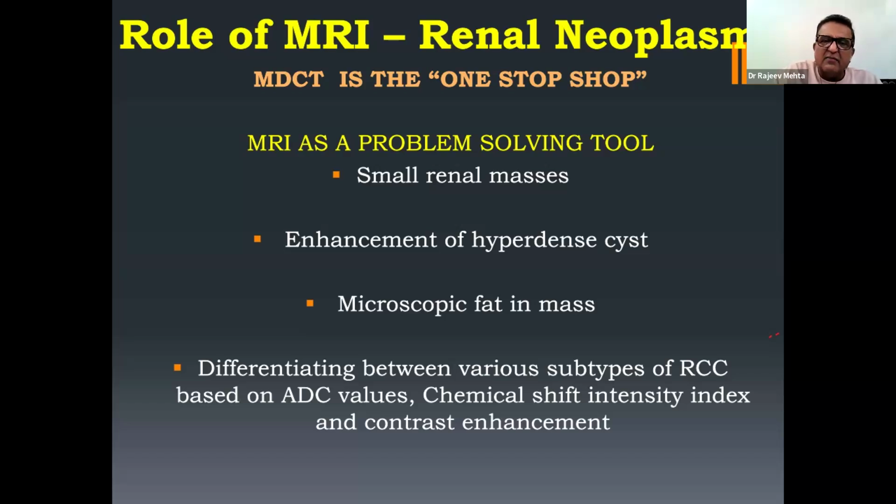At the same time, the second indication is a hyperdense cyst. Hyperdense cysts are commonly encountered in routine CT scans, and can be due to underlying intrinsic hemorrhage or, at times, proteinaceous content. Now, when there are tumors, if the cyst on a follow-up scan increases in size and is undergoing malignant transformation, when you inject contrast, because of the hyperdense nature of the cyst, you cannot identify the degree of enhancement on the CT itself.